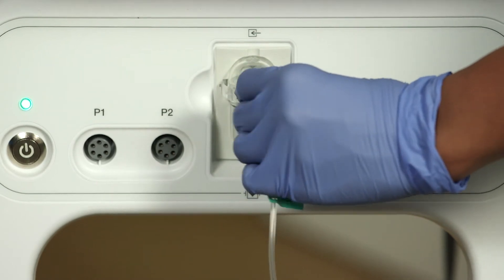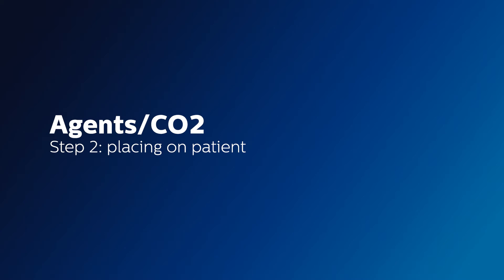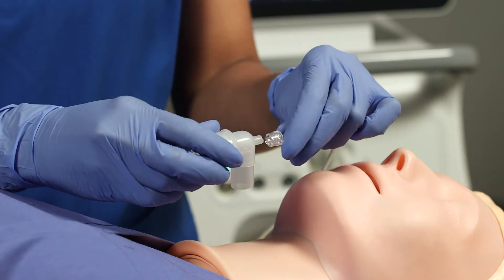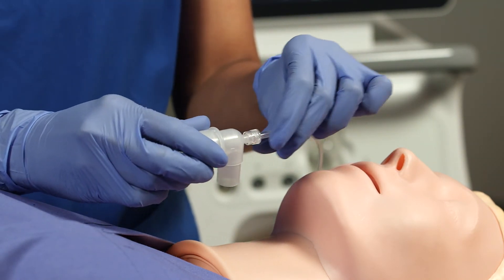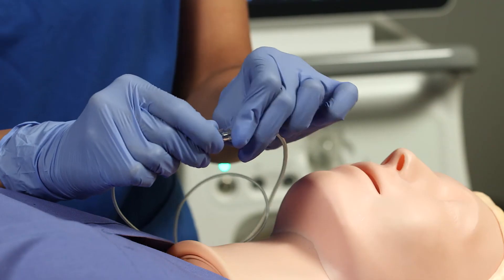The sample line is single patient use. When connecting the sample line to the elbow tube or a nasal cannula, it is important not to add any additional connections.